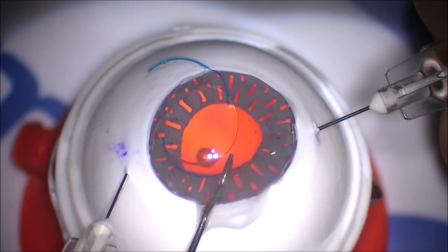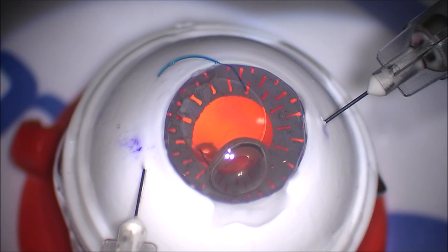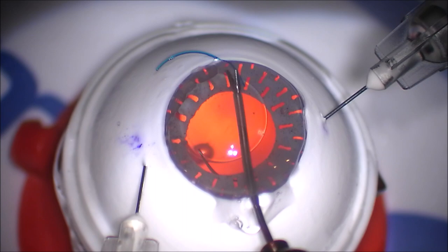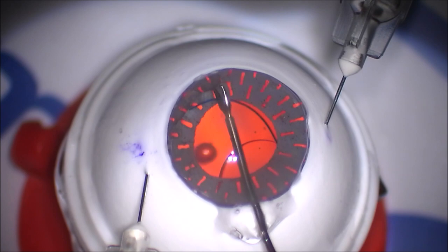Whenever you're doing intraocular manipulations with the practice eye, you can introduce air. Just push some more viscoelastic in. I go ahead and internalize the leading haptic with the micro forceps.